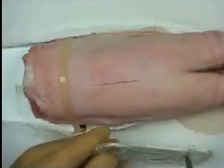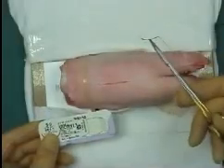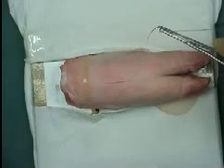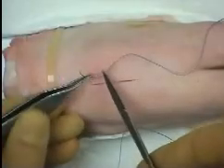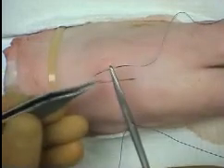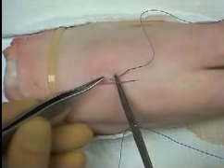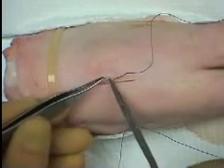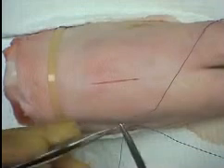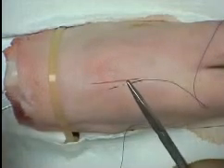After opening the suture pack, the needle is presented ready for mounting in the needle holder. Grasp the needle with the tip of the needle holder, two-thirds along the shaft from the needle tip. When removing the suture from the pack, it is often useful to use your little finger to take up the slack in the suture. The needle can either be held two-thirds away from the tip and perpendicular to the needle holder.